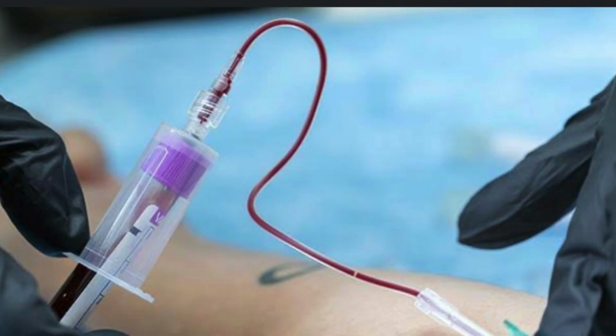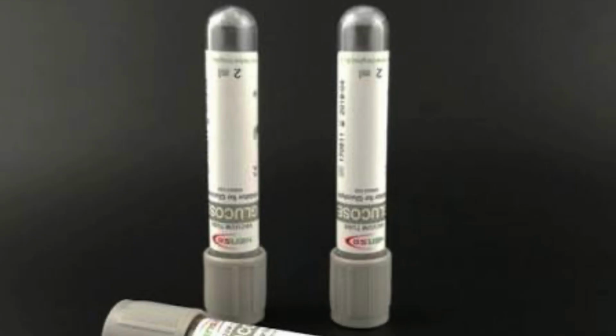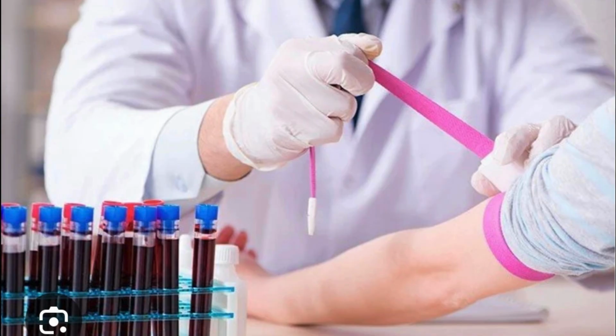We're going to move on to the gray test tube. The gray top tube contains sodium fluoride. The combination allows preservation of glucose in blood samples for accurate glucose measurement, and the prevention of clotting, ensuring plasma or whole blood can be analyzed properly. This tube is used in clinical chemistry laboratories for fasting glucose tolerance tests, and also for blood alcohol testing.